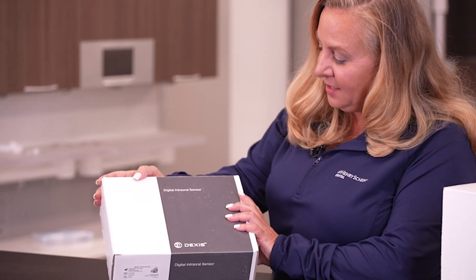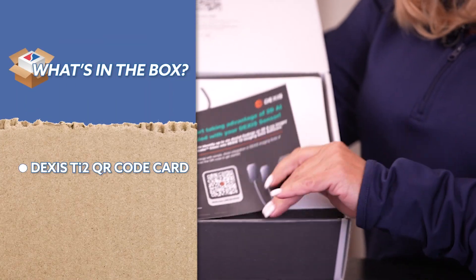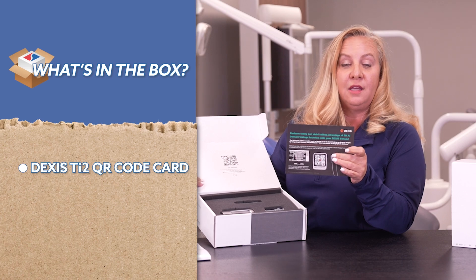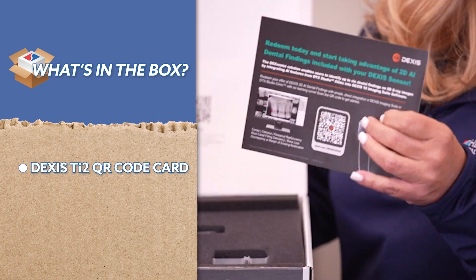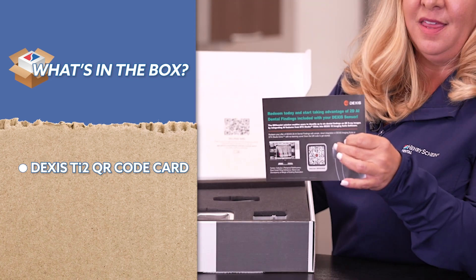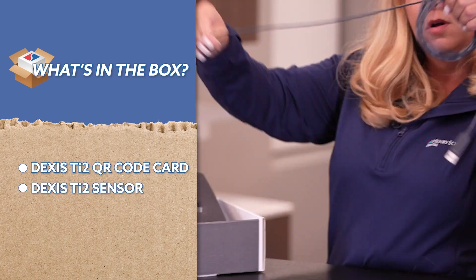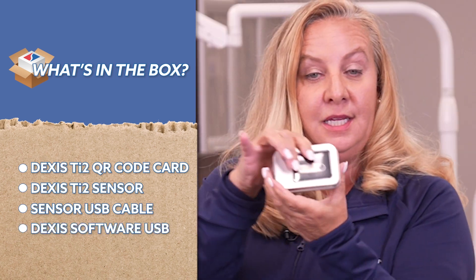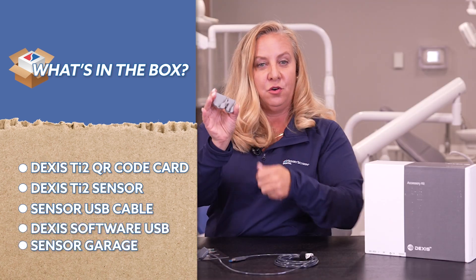This first box contains the actual sensors themselves. When you open the box, there's a little card with a QR code. This is really convenient for offices who already have the DEXUS imaging software — you're able to scan this QR code and then activate the AI that we're going to talk about. You also have the sensor with the cable, the software, a little USB, and your sensor garage.